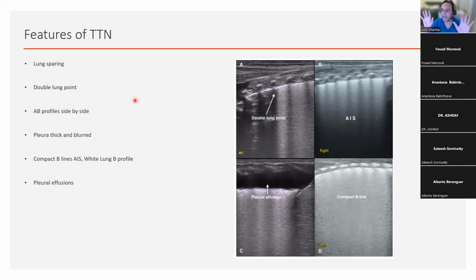My expectation is that by the end of this course, you become proficient and competent at being able to diagnose pneumothorax, RDS, TTN, have good proficiency in diagnosing pleural effusions, pneumonia, meconium aspiration. And for those of you keeping logbooks, the expectation is 25 scans, 50% of them should have pathology.